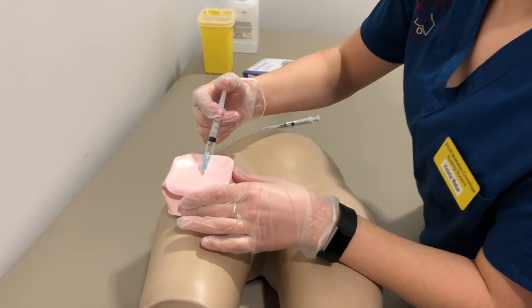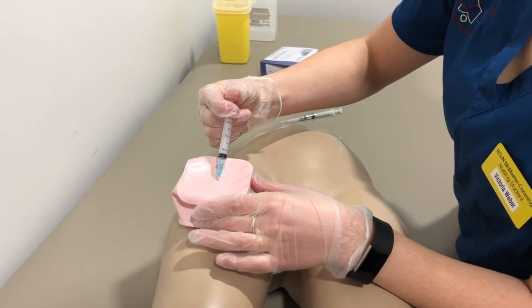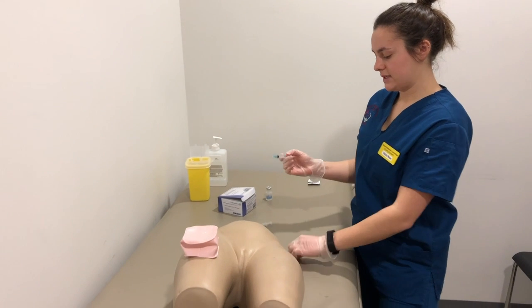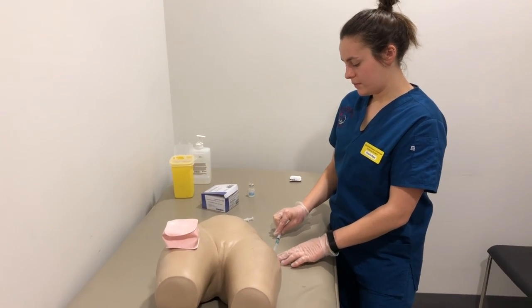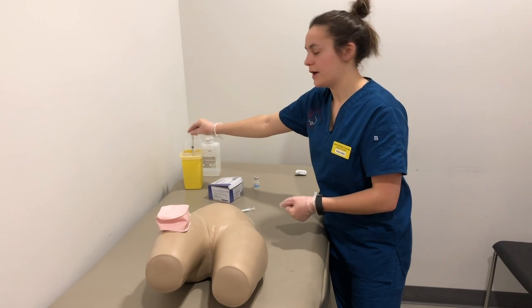And you're going to slowly inject the medication. And pull it out. Next, I am going to put the sheath back on appropriately so that I do not cause harm to myself, and dispose of it within the sharps container.